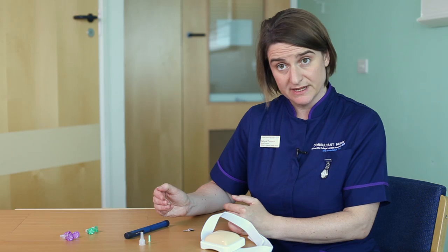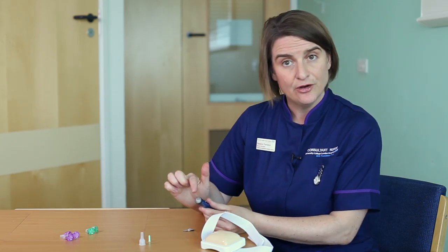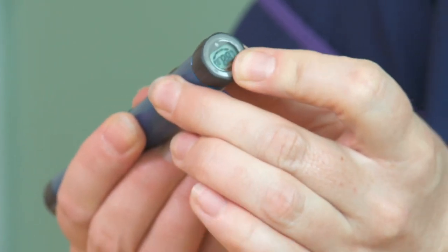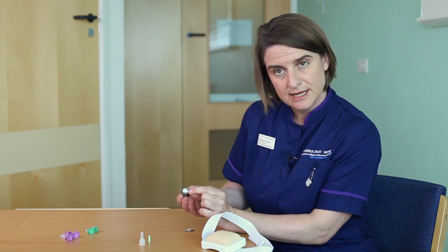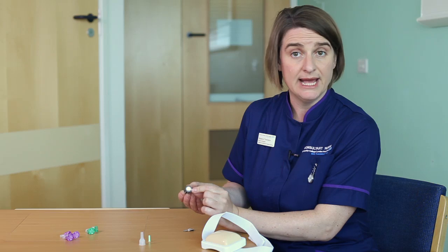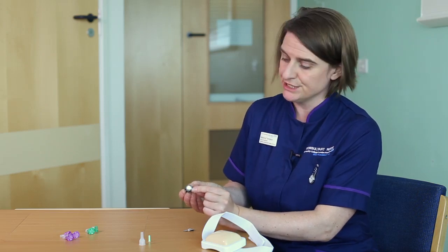Some pen devices have memories on them. This particular pen has a memory on the base of it. If I pull the lid out and then push it back in, it will tell me the number of units that was last injected and also how many hours ago it was given. So that can be a helpful reminder if you can't remember when you last gave an insulin injection.